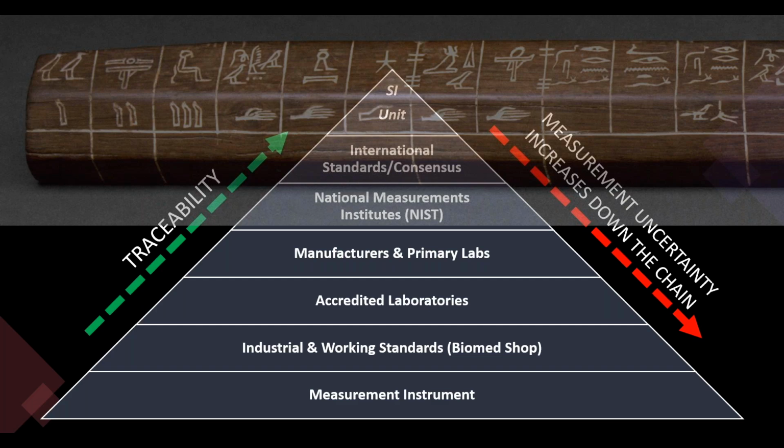The reason I make this point is that a device like that can have a lot of other uses in your shop besides temperature. It could be used for a lot of other functions within your hospital for the same value as something of actually less accuracy that only measures temperature.